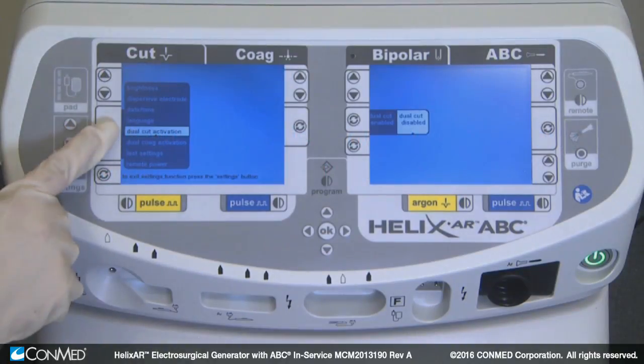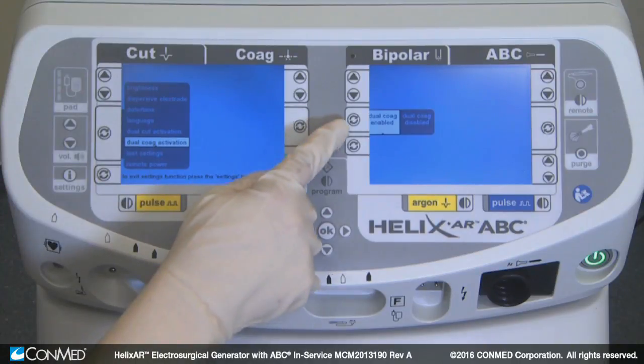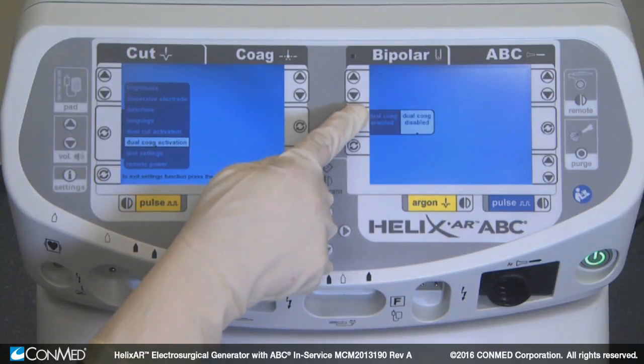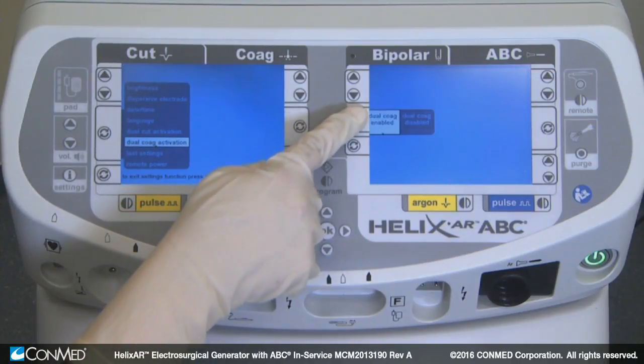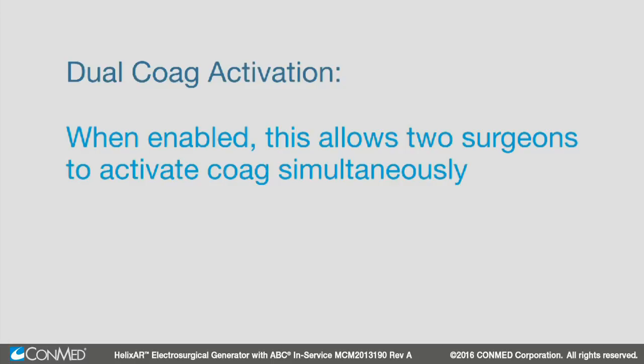Dual coag activation enables or disables dual coag activation. When enabled, this allows two surgeons to activate coag simultaneously.